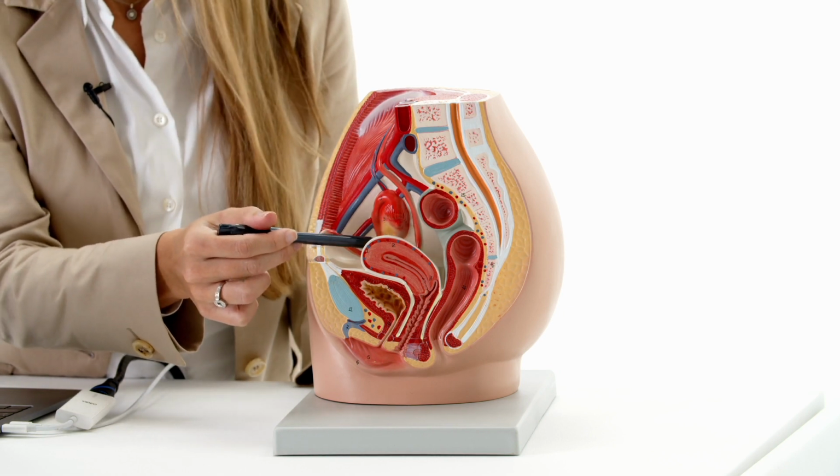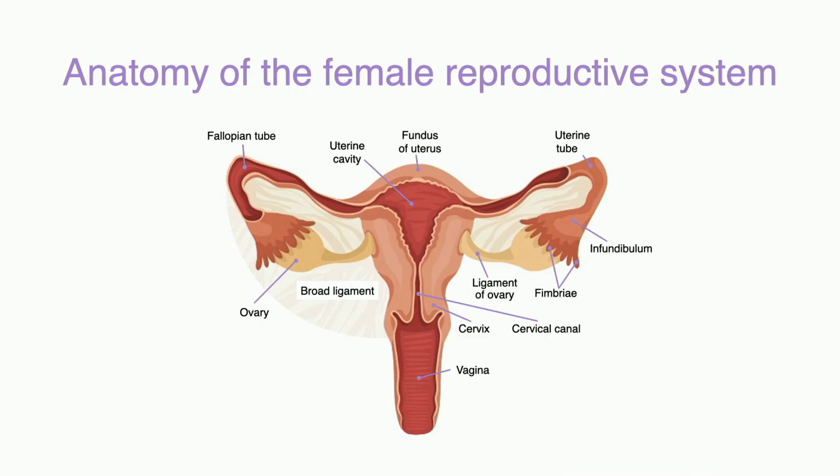The ovary is close to the iliac vessels. The ovaries are suspended laterally and posteriorly to the uterus. The supporting structures of the ovaries include the utero-ovarian ligament that attaches the ovary to the uterus and the infundibulopelvic ligament, also referred to as the suspensory ligament of the ovary, through which the ovarian vessels travel. Finally, there is the broad ligament, which condenses to form the mesovarium.